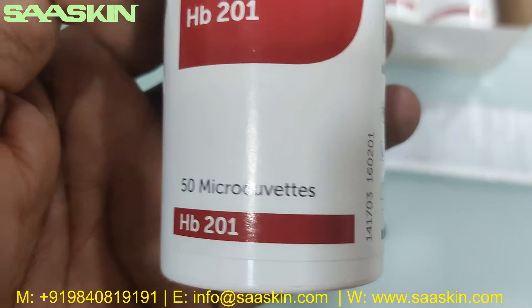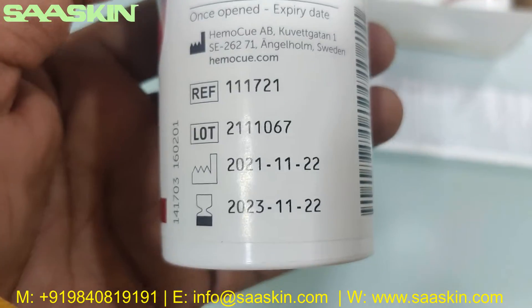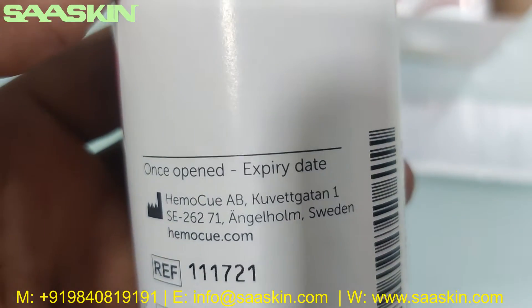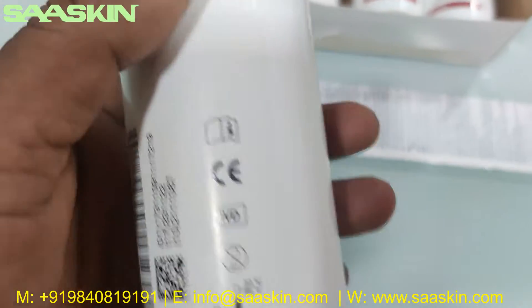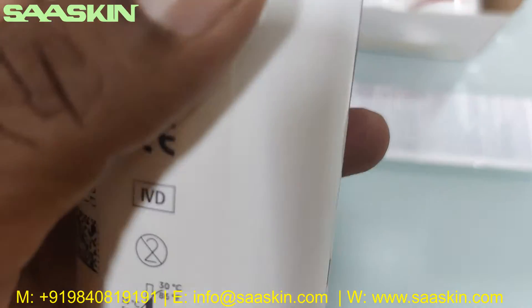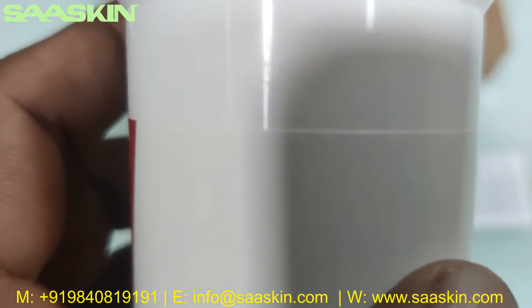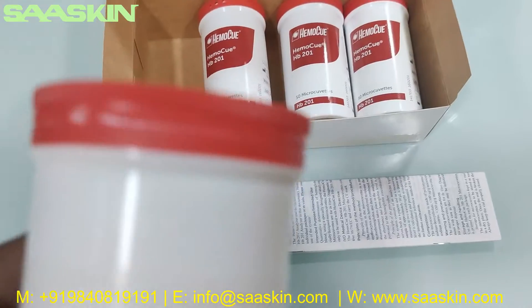This sub-box says 50 micro cuvettes, Hb 201. It carries your expiry date of a two-year period, and it states the manufacturing is from HemoCue Sweden. This box is completely sealed.